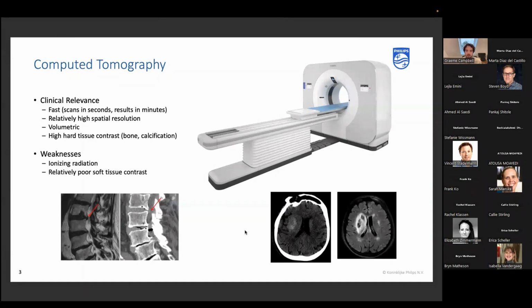So this is where often we're in a case where CT is performed first, but then something is inconclusive, or we need to know more, and then other modalities are performed. But that, of course, takes longer for a diagnosis, or sometimes there are contraindications. There are metal implants or something, or claustrophobia, or just availability.